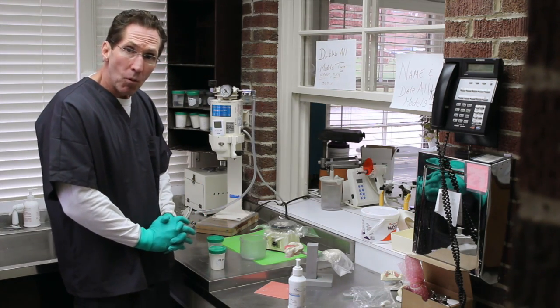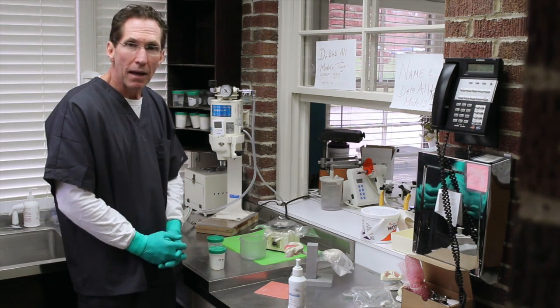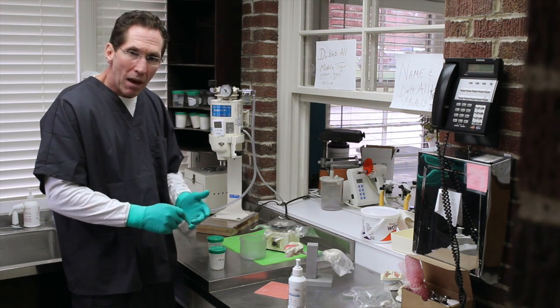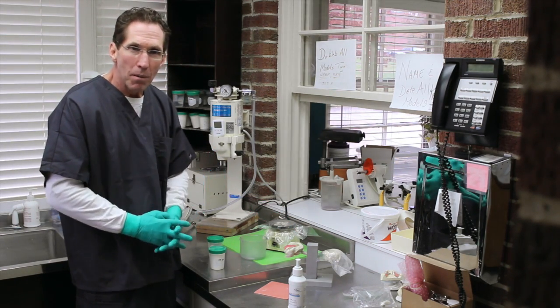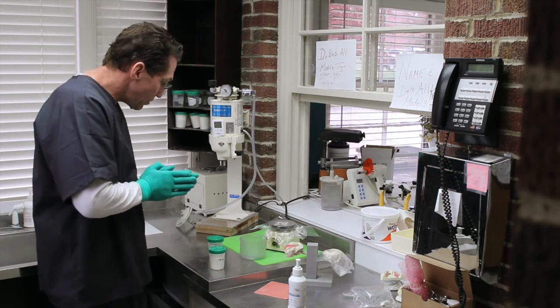Now, if at all possible, we highly recommend using a vacuum mixer, which we're going to be using and demonstrating today. If by some chance you don't have access to one, what I would recommend is still use that same water powder ratio, but when you have your stone mixed, take it on the vibrator, put the vibrator on high, and let that vibrate out a lot of the bubbles. You can still remove a lot of the bubbles with that. But let's use the vacuum mixer.